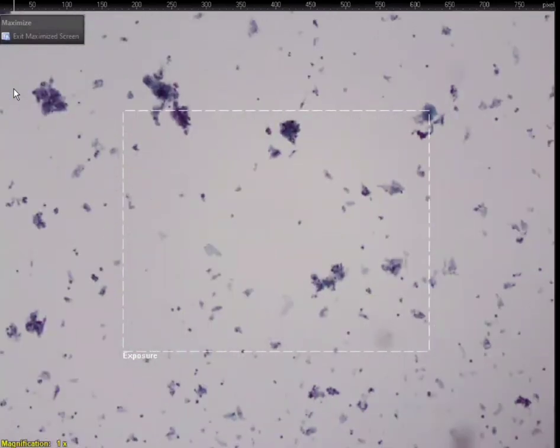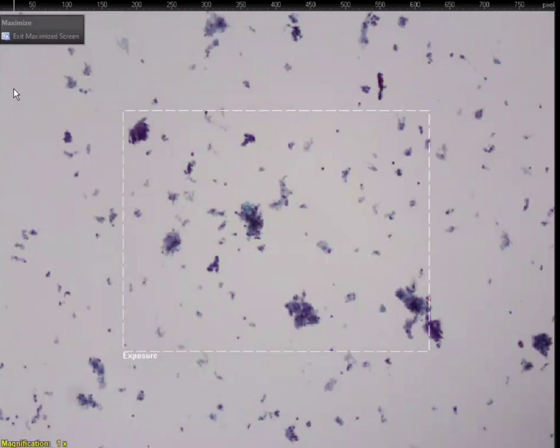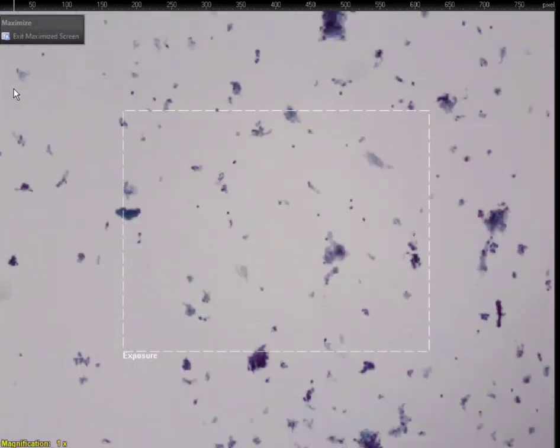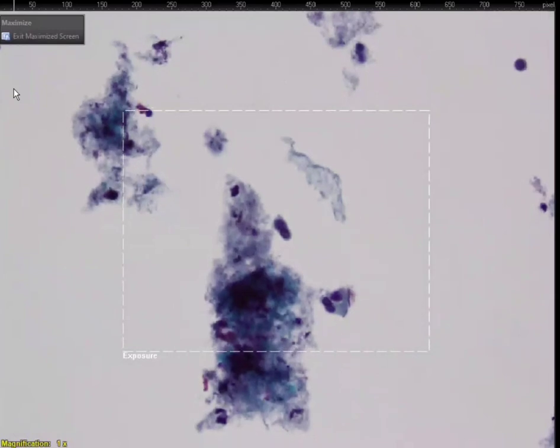So I would look at imaging. Is there a mass? Maybe they missed it. What's the clinical suspicion? What are they thinking, right? Yeah. And then see if we can make something out of this. Exactly. You know, is there something in here that whatever they're thinking?